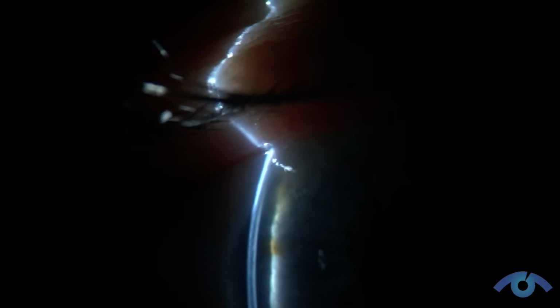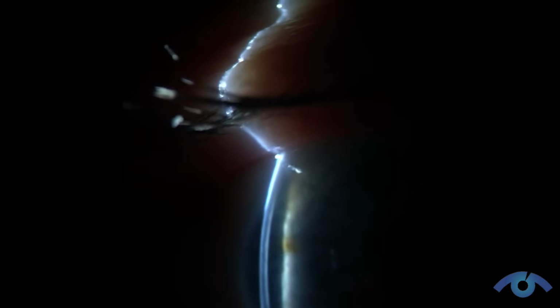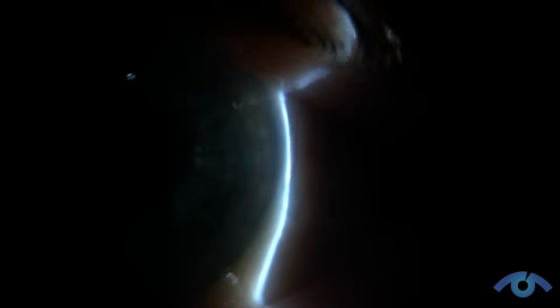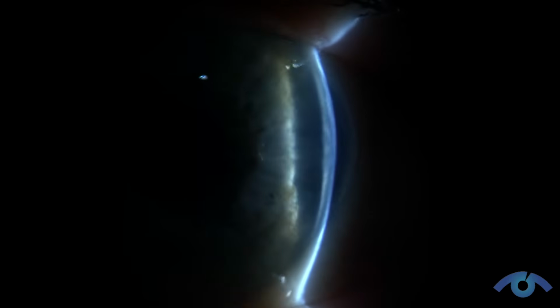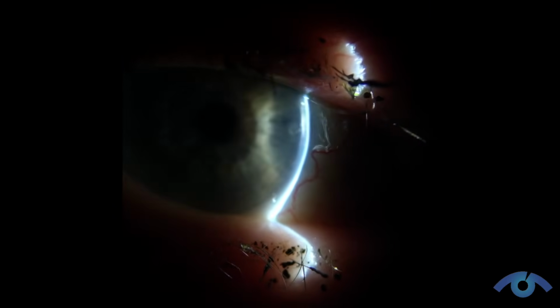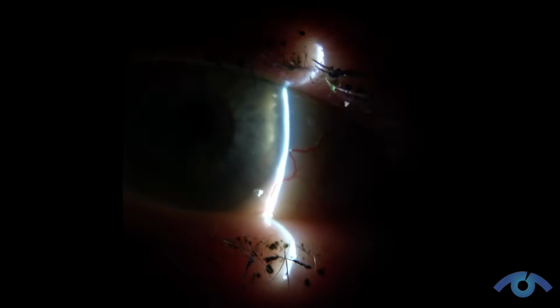In the early part, you can see the layers of the cornea, you can see the depth that's present. As you draw it across the iris, you can see that the iris gets further away from the cornea because the cornea has a dome shape to it. And again, here you can see the area become greater as the cornea sweeps upwards relative to the iris. It stays relatively flat. Again, in this one, you see the same thing. So many versions of an open angle and how the iris contour is relative to the corneal curvature.